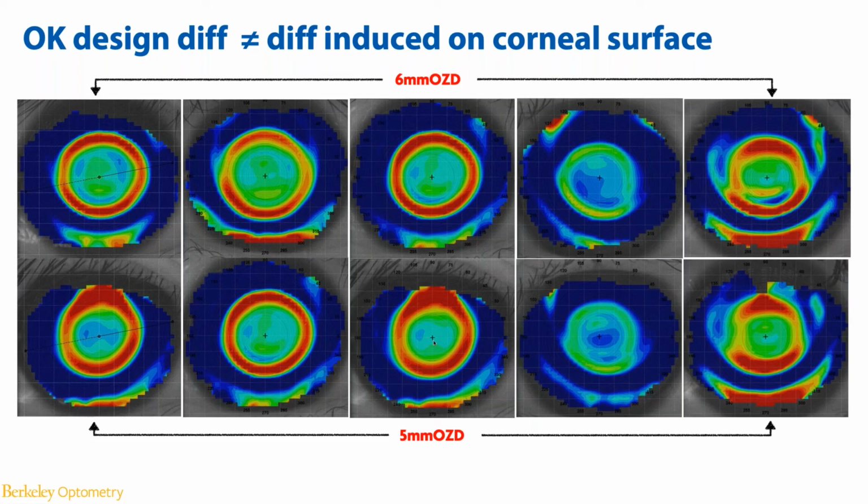I found so far I've had 4 patients that I have successfully troubleshot, who have pretty ideal centration and great ocular surface health, but just a tiny bit of undercorrection due to a slight undercorrection of the corneal center.